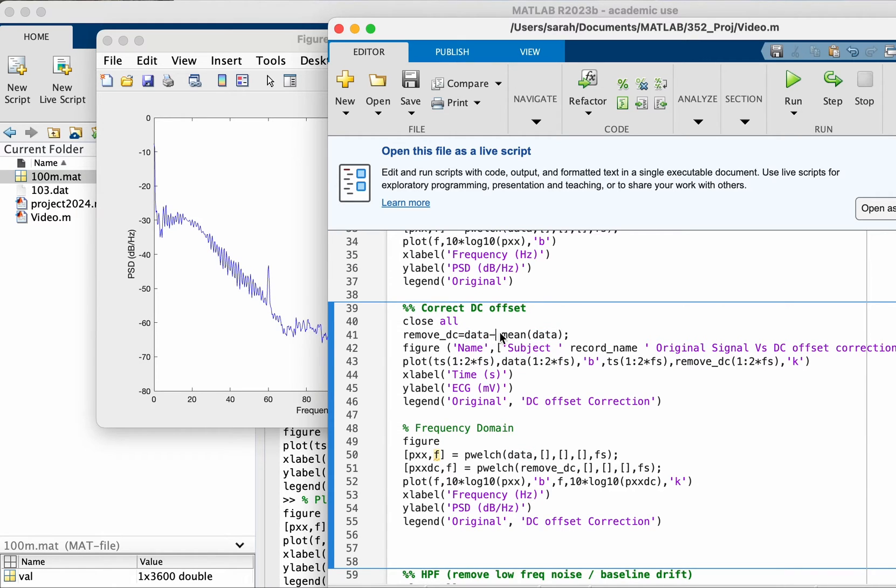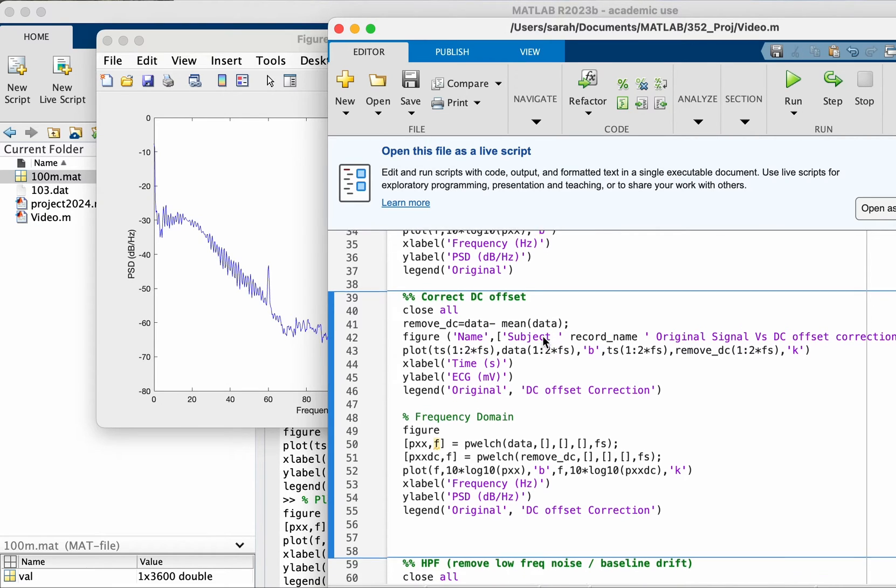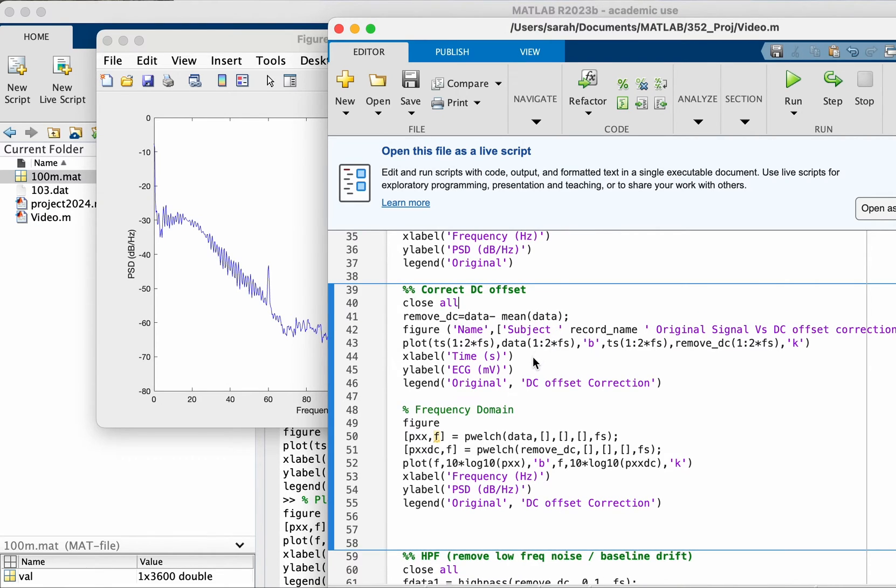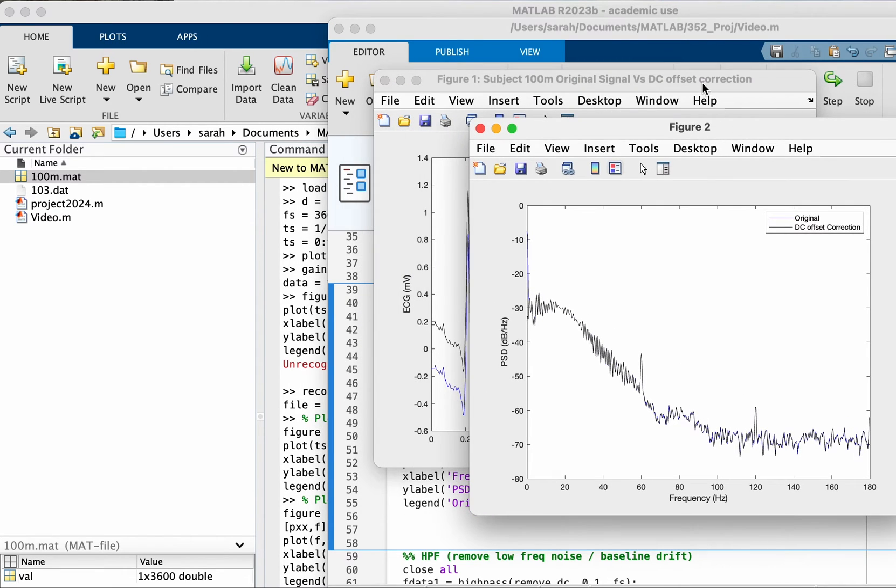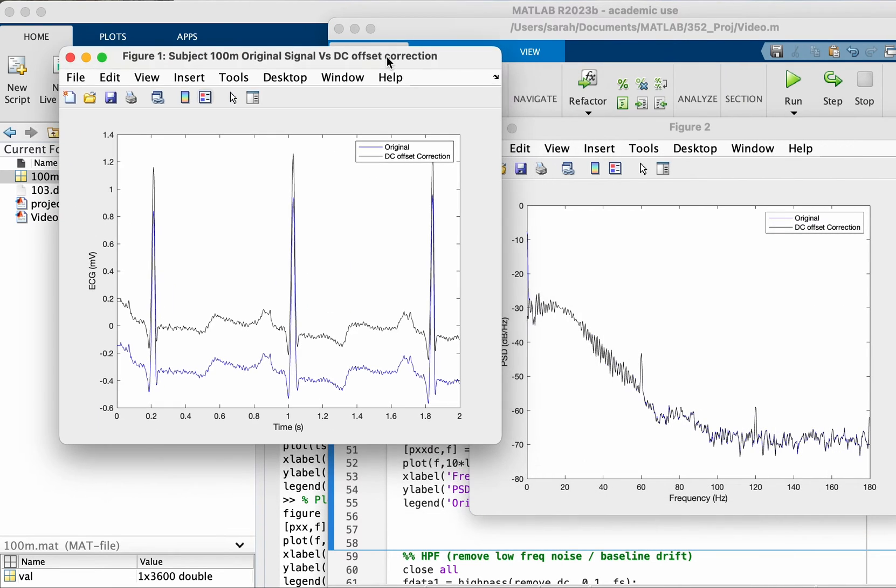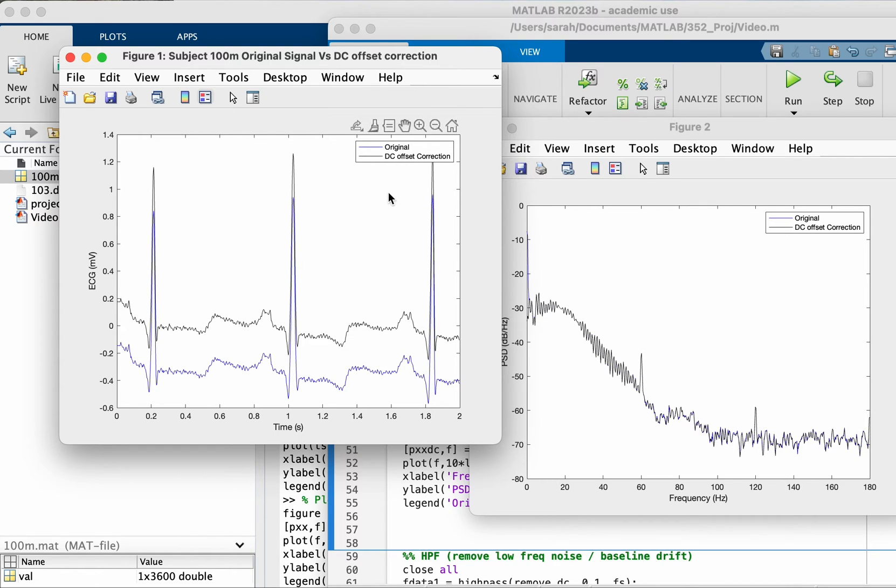But before that, let's address the DC offset. To remove the DC offset I'm going to subtract from it the mean. So let's look at the before and after we do this.